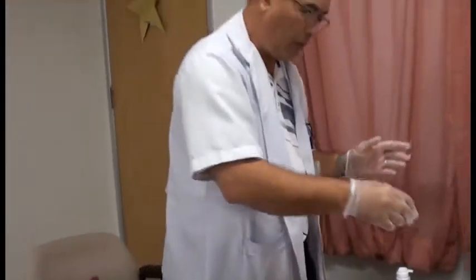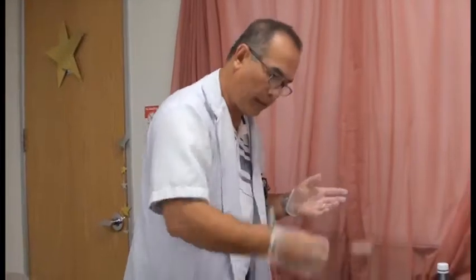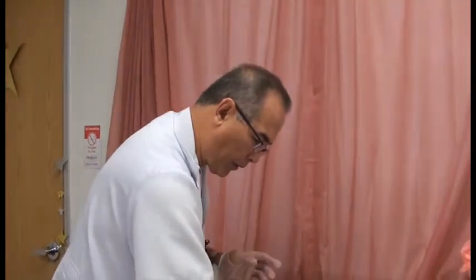So if you look back here, these are the brush that is used for actually cleaning or scrubbing the inner cannula. But these days we really don't do that anymore, since most of our patients will have disposable inner cannula, and as I said, we don't need to do that. And so this is the cleaner, and this is a pipe cleaner. You actually insert this inside the inner cannula to make sure that it's dry and not moist before you put it back into the patient. So we essentially really won't be using this at this point.